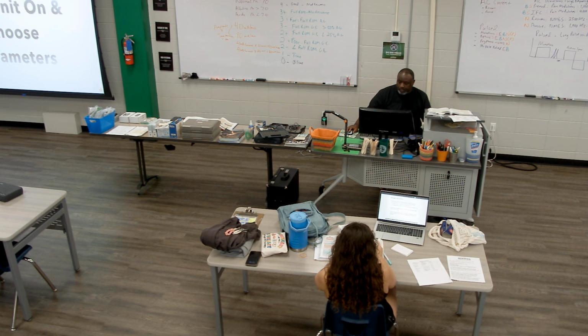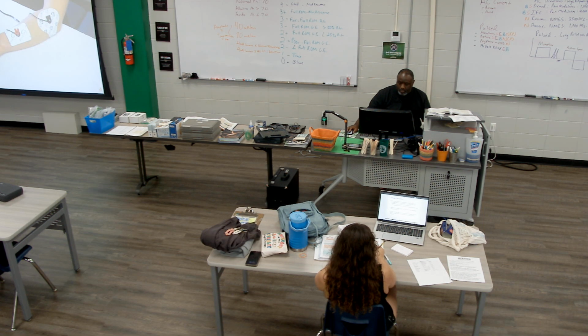Turn the unit on and choose the appropriate parameters based on patient tolerance. The typical dosage is 40 milliamp minutes. And so if you scroll to the right on this device, you'll see it when they scroll to the right. Let me see if I can get it back far enough. Yeah. The typical dosage is 40 milliamp minutes.